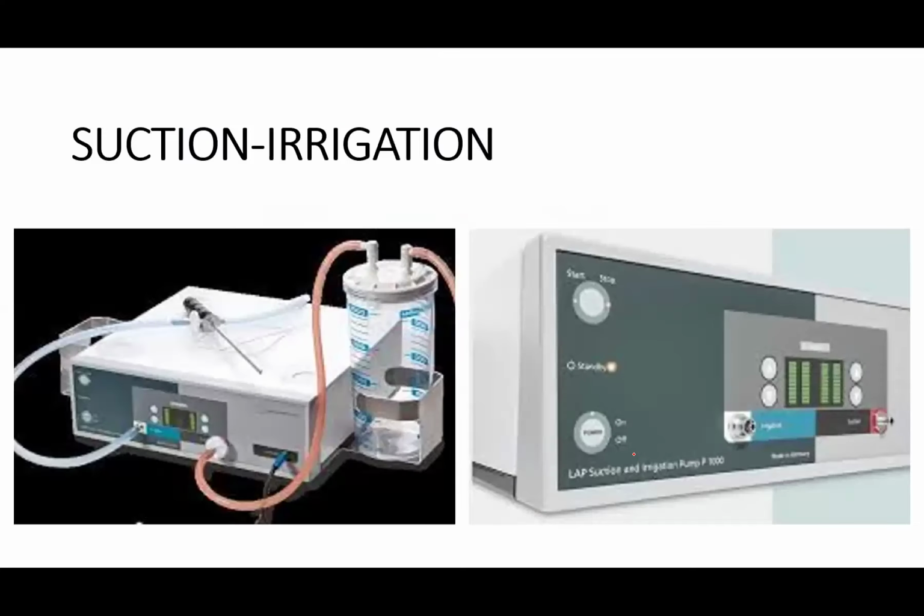Now, if you look at this suction irrigation device, it has both the irrigation system as well as the suction system inbuilt. This is a very good machine because for this, you don't need a separate suction machine because it is inbuilt.